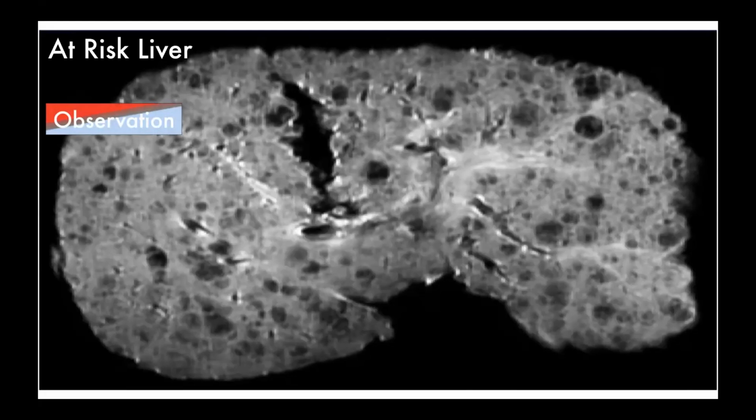One important terminology change. We don't describe nodules as nodules or lesions or masses or tumors. We describe them as observations. Ideally, we report the top 5 observations depending on the probability indices in any kind of cirrhotic liver or at-risk liver.